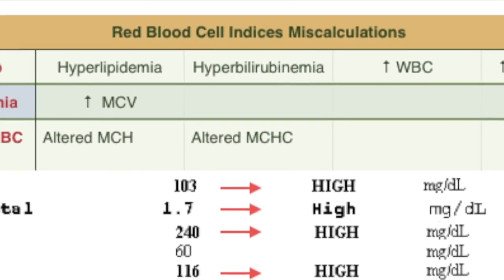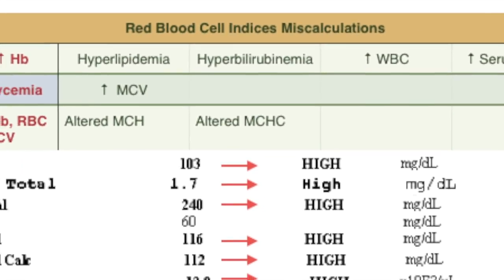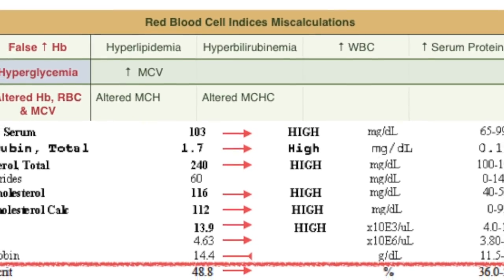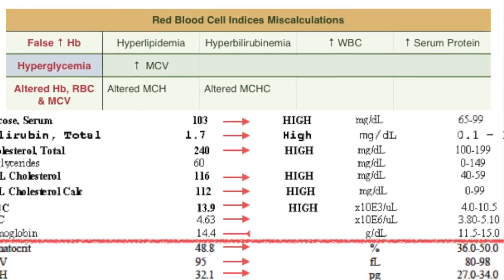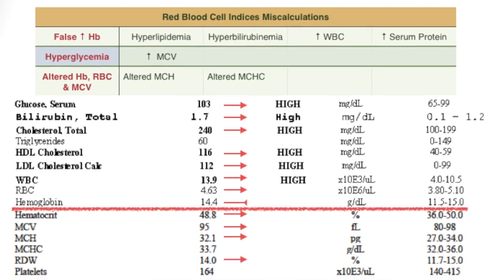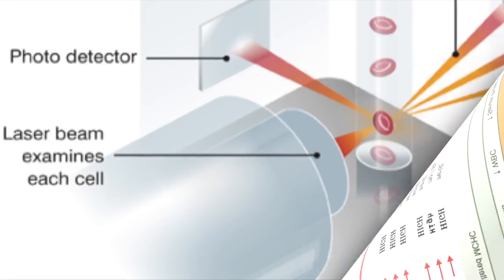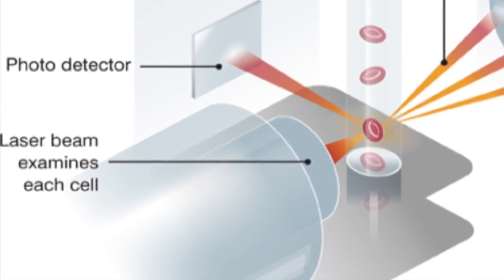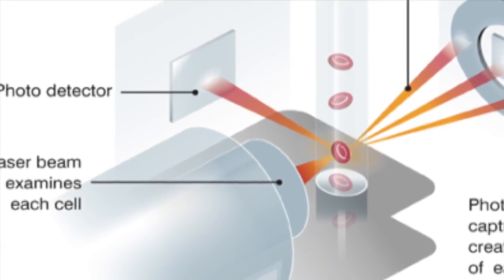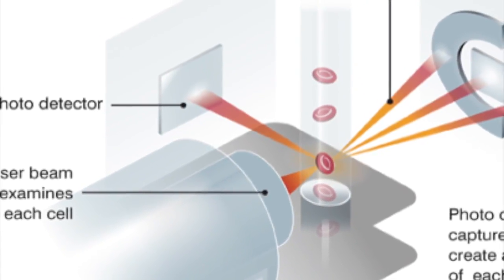The presence of immunoglobulins and fibrinogens precipitated by low temperatures in the blood sample leads to interference with cell counts, resulting in spuriously increased white blood cell counts and sometimes small elevations in hemoglobin, hematocrit, red blood cell count, and a slight decrease in MCV.